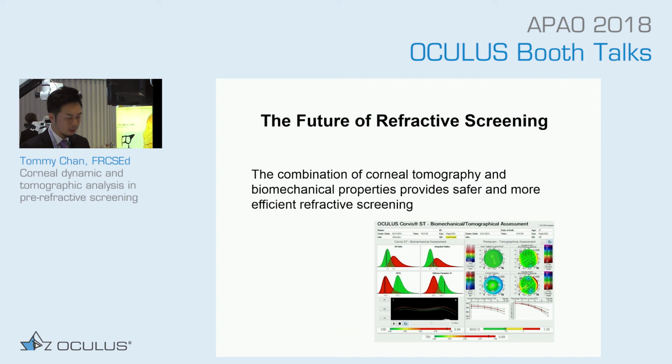And so in the future, we believe that combining the two properties can provide a safer and more efficient refractive surgery screening. And thank you.